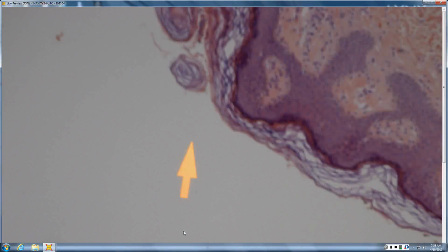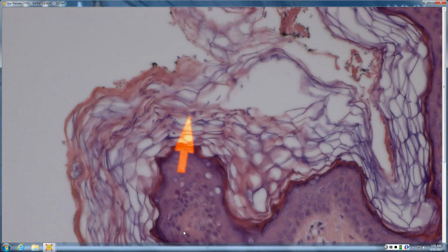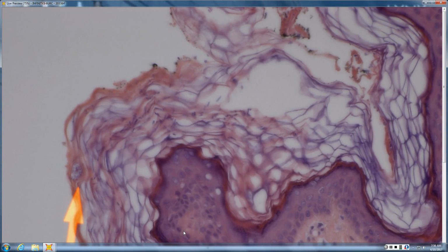And if you want to look higher, another thing that is characteristic for TV is that the hyphae are gray in H&E, whereas neither tinea nor candida pick up stain significantly. TV is very, very gray, and you see the spaghetti and the meatballs here. Does it grow on Sabouraud's? No, I don't think so. You have to have the oil, right? What would go with spaghetti and meatballs? Olive oil to make it grow. Correct.